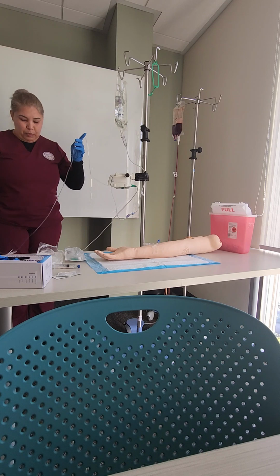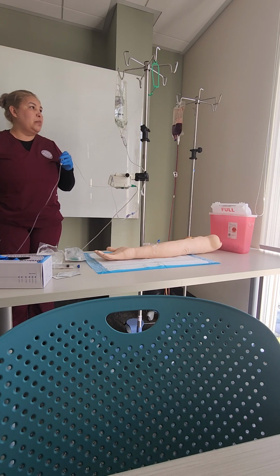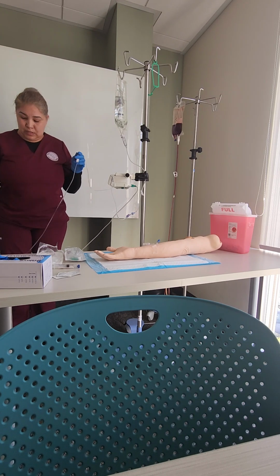So the reason why we want to prime is we want to make sure that all the air bubbles are out. We do not want to put any bubbles into our patient and create a possible embolism that can be very harmful for the patient.